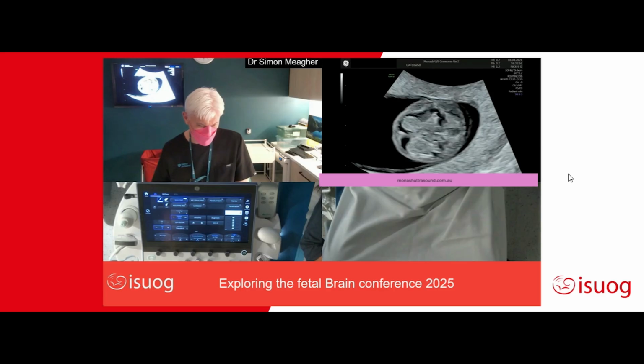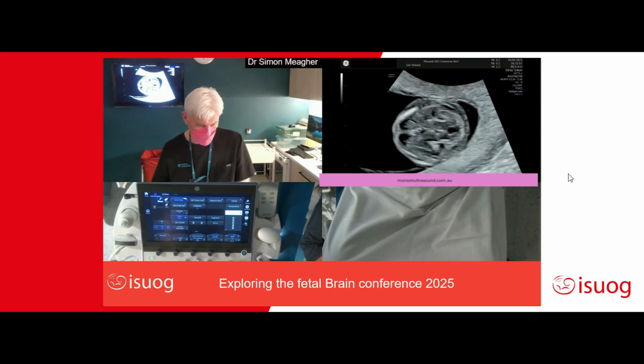The next, when you move down from the lateral ventricles, you will see that the third ventricle is larger at this stage, in reference to the head size. The aqueduct is larger in reference to the head size, but the aqueduct is juxtaposed to the occipital membrane, a juxtaposition which we've described as a marker for spina bifida at 12 to 13 weeks. Every baby at 10 weeks of gestation looks as though it has midbrain displacement. And therefore, you can't use midbrain displacement or the crash sign at 10 weeks, because that's how a normal brain looks. It's an important point to make, and I'll make reference to this in my talk on spina bifida.